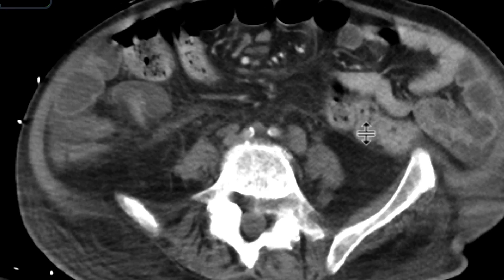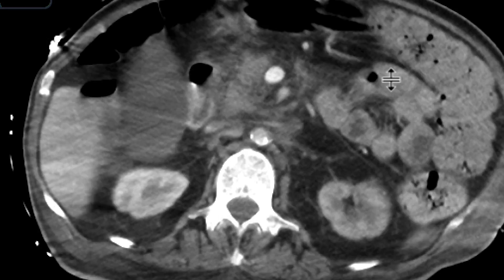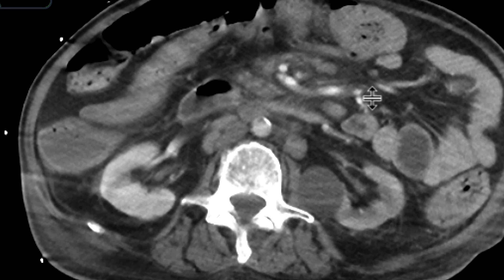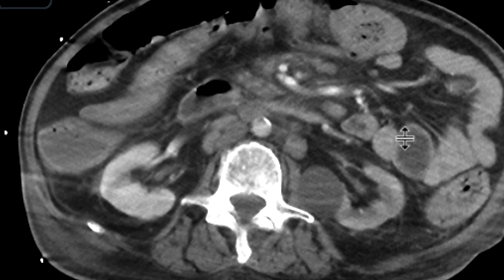But the finding I wanted to alert you to was the left kidney. If you look at the left kidney, we notice that the enhancement pattern is a little off when you compare it to the right kidney — it's enhancing a little bit less. There's some streak artifact from the patient's arms being imaged to the side, but that doesn't really account for that finding. The fact that it's so unilateral tells us that there's something going on with that left kidney.